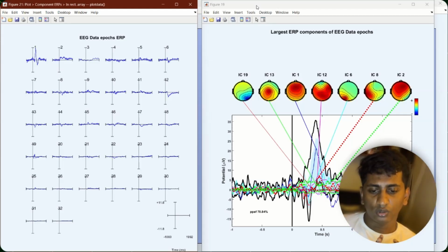This LDA has numerical stability, with no hyperparameters beyond shrinkage, like the Ledoit-Wolf recommended automatically. That is an EEGLAB specialty. You can use that. You can also use SVM. The kernel will be linear, kernel equals linear. C is 1 initially. We use grids like C belongs to 0.01, 0.1, 1, 10 with nested CV.